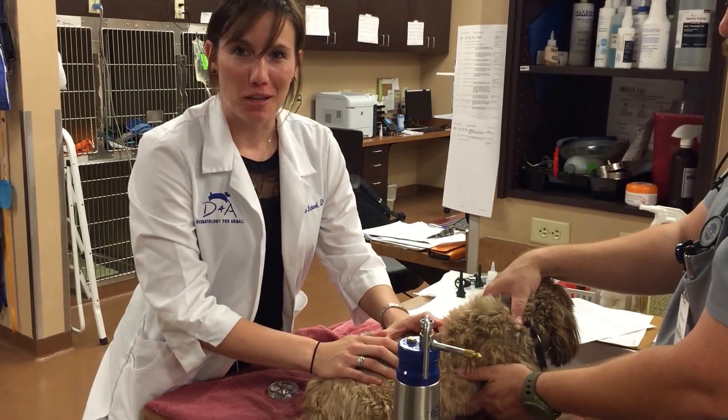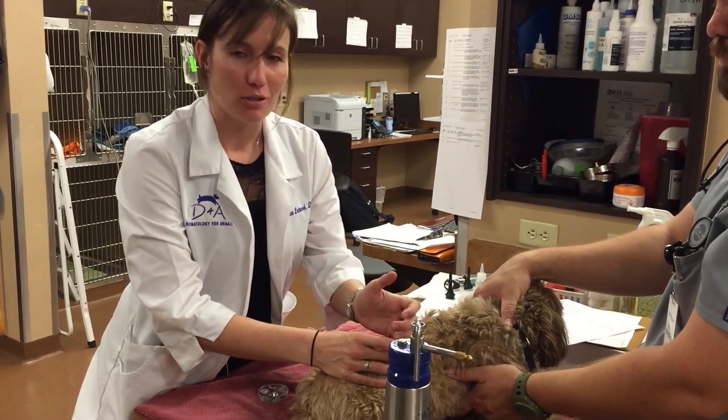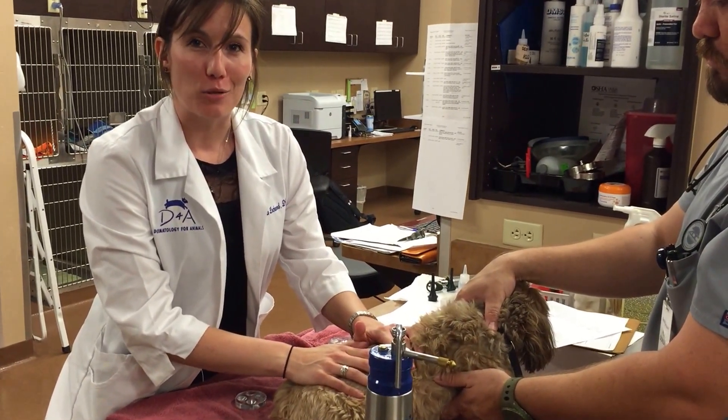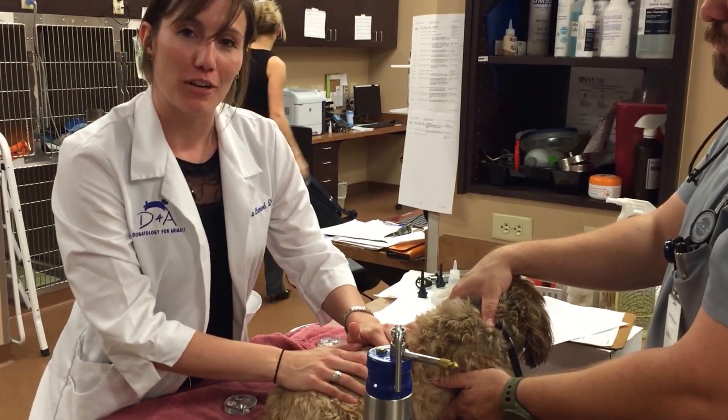Hi, I'm Dr. Lockwood with Dermatology for Animals, and I'm going to show you how we can do some cryotherapy to remove small masses on our little friend Coco here.